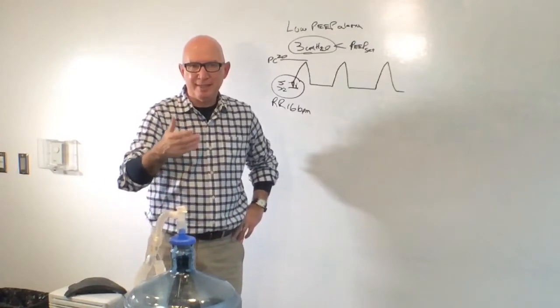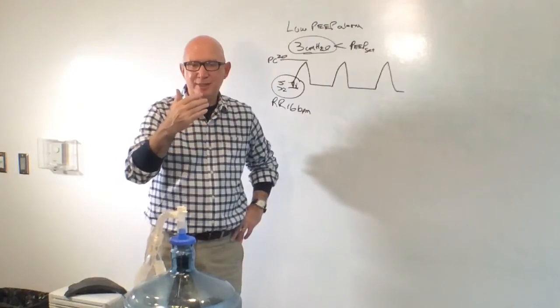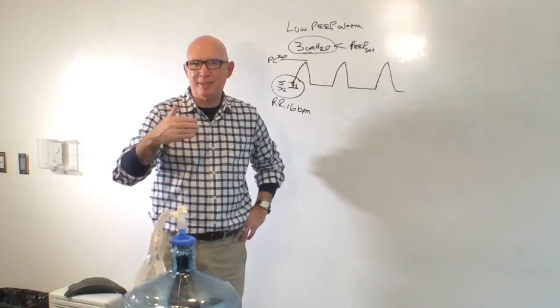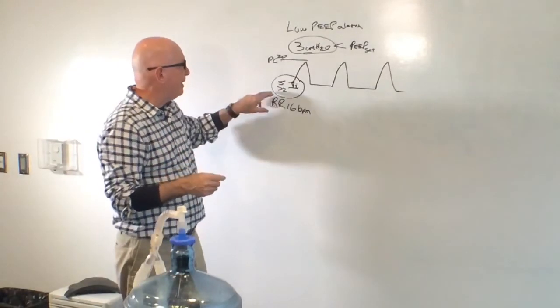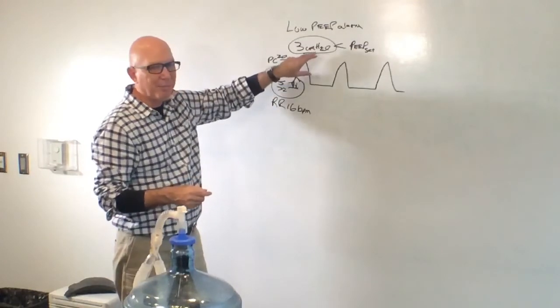And so you can see that if a heart rate monitor or blood pressure, etc., was decreased as far as its alarm limits were concerned, and so the alarm was not triggered, then you could have an adverse event which would be detrimental to the patient. And so, having said that, that was my sidebar, because I'm telling you now that you can actually change this alarm limit for your low PEEP.